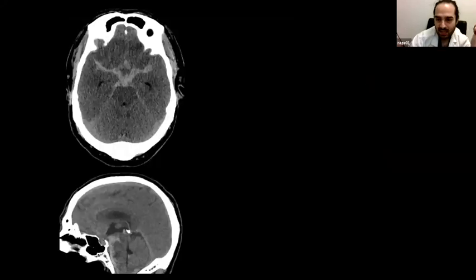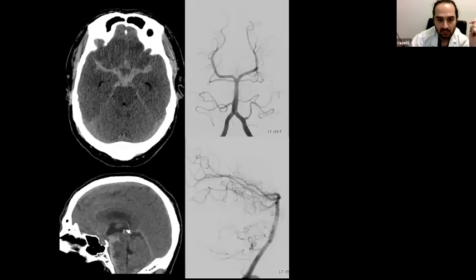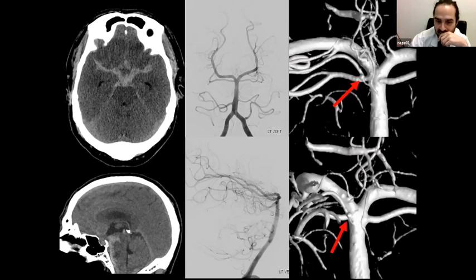Other example, like subarachnoid hemorrhage in the posterior fossa. You do 2D imaging, really nothing shows up. What's exactly ruptured here? It really looks like an aneurysmal subarachnoid hemorrhage. And there it is, by looking better at the highest possible resolution image, you see this little perforator-like aneurysm coming from the back of the basilar artery.